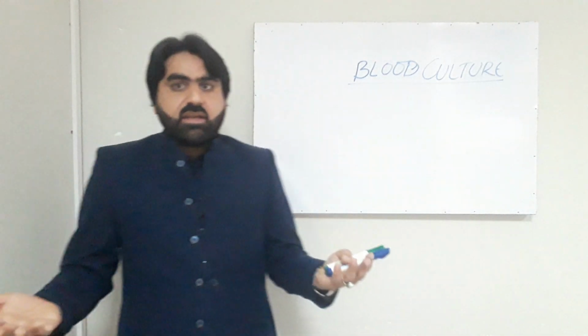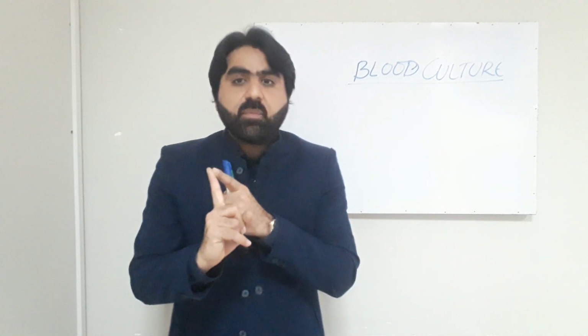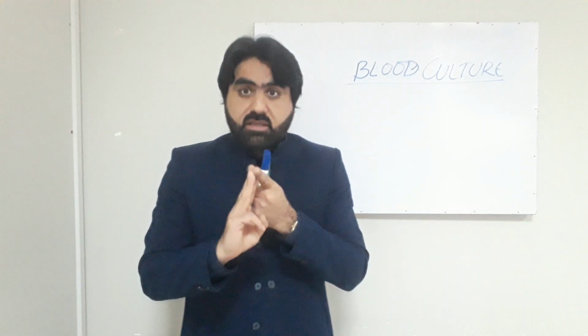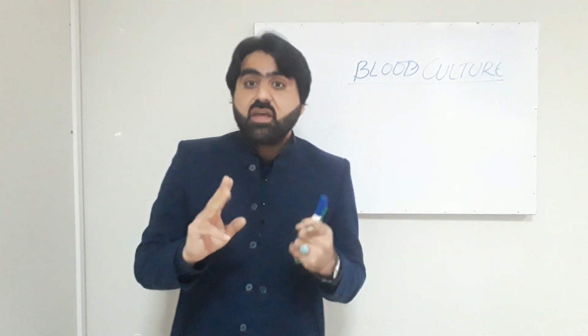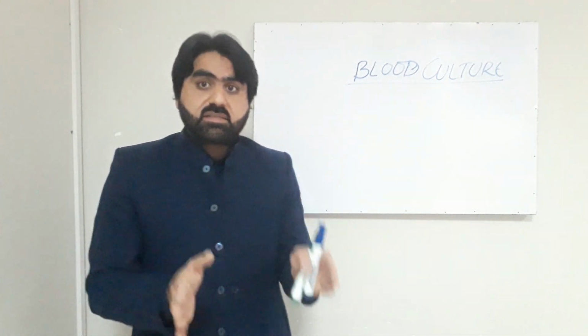The available literature tells us that 1 blood culture set recovers 73% of the pathogens, 2 blood culture sets increase this recovery to 89%, and 3 blood culture sets increase this to 98%. Therefore it is preferable to use 3 blood culture sets for an adult.